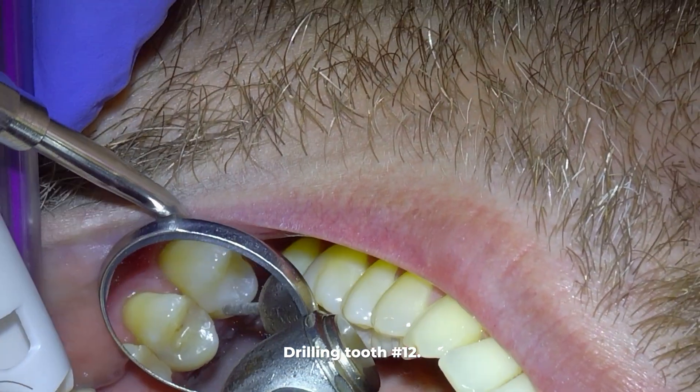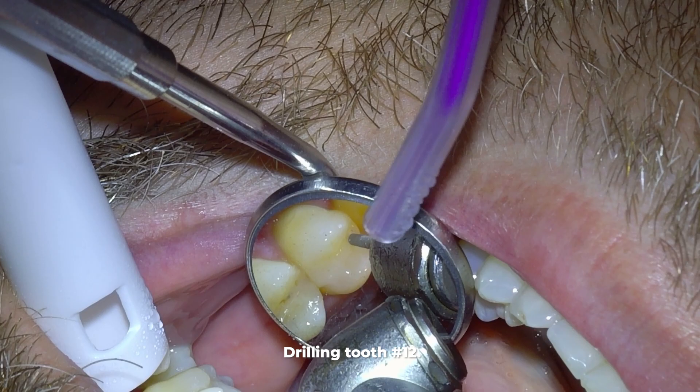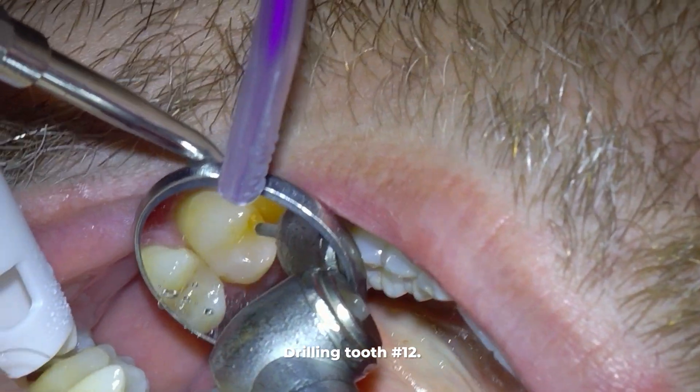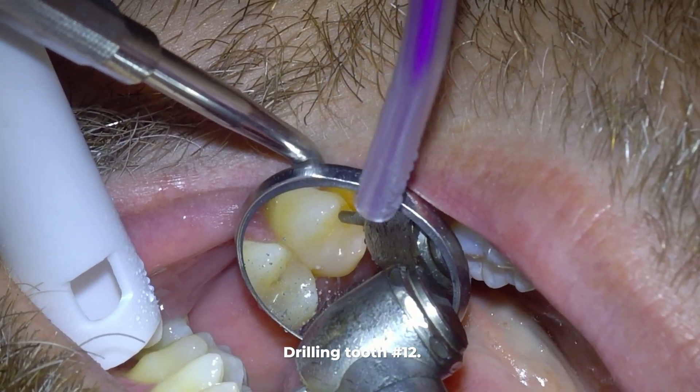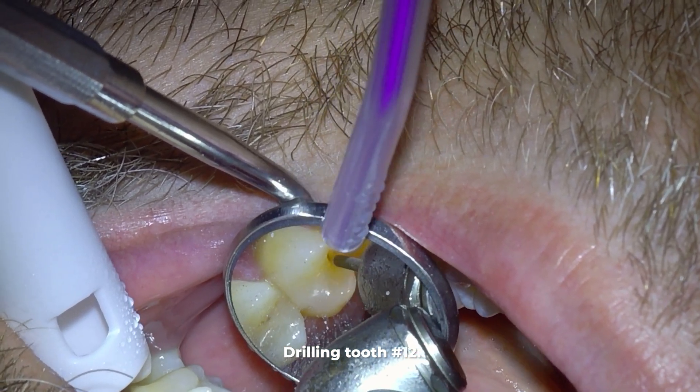We start by drilling on this tooth, and then on the tooth behind it we are drilling straight down to the cavity on tooth number 12. I want you to see things as dentists see them — meaning we look at the tooth through the mirror while drilling.